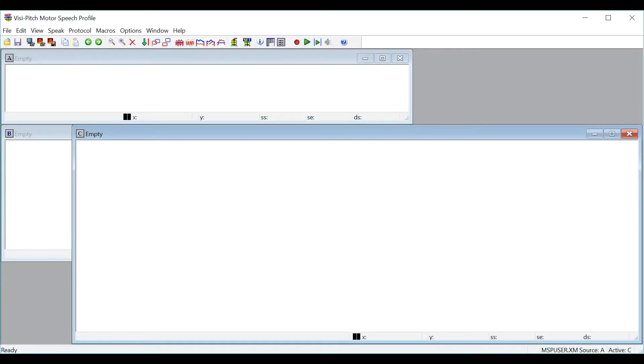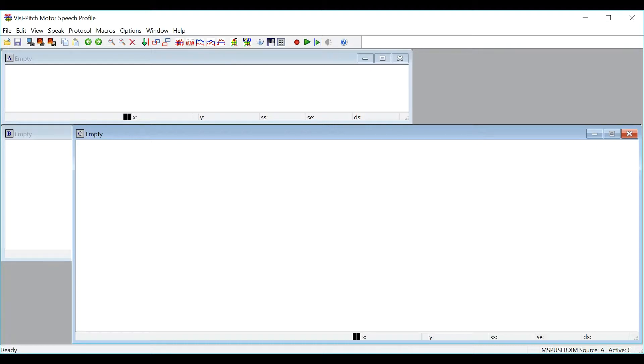In this video, we will be going over Motor Speech Profile. Motor Speech Profile is an assessment module that captures and displays speech samples and measures acoustic parameters associated with motor speech disorders. The analysis is completed using speech stress test protocols that target specific motor speech functions.